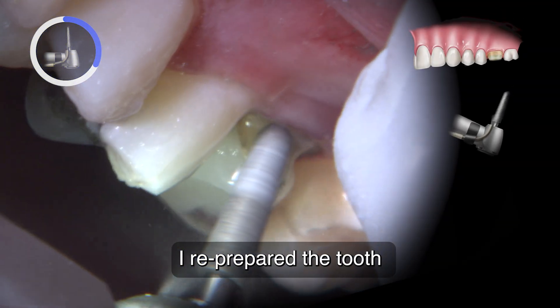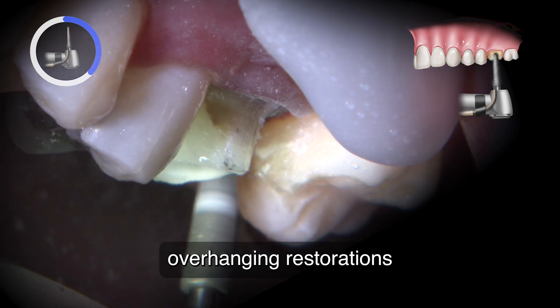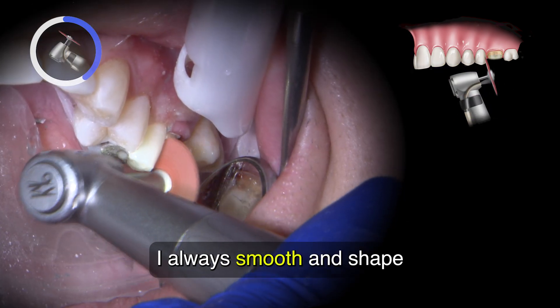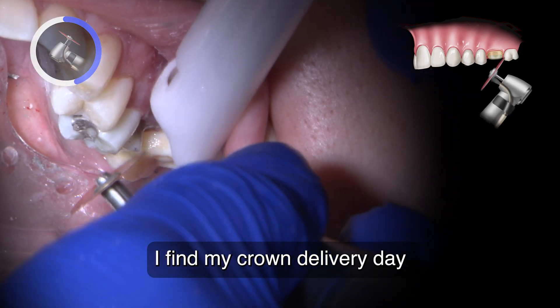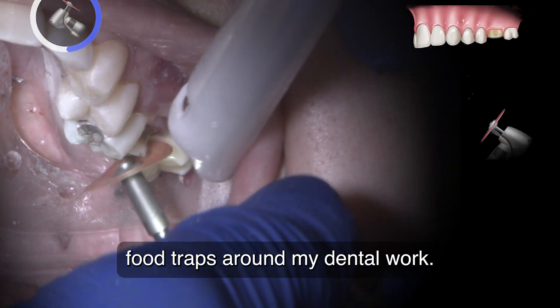I re-prepare the tooth with a deep chamfer margin. When neighboring teeth have overhanging restorations or will become a problem for my final crown's path of insertion, I always smooth and shape these neighboring teeth. I find my crown delivery day is more predictable and it prevents future food traps around my dental work.